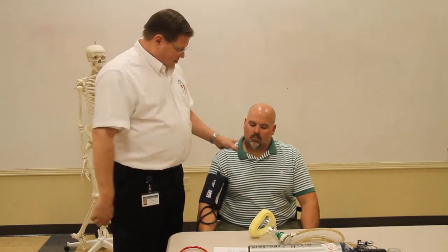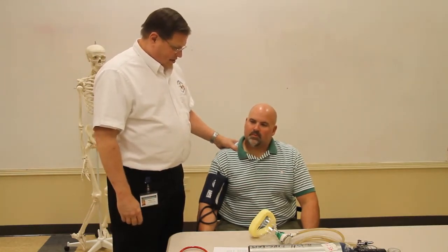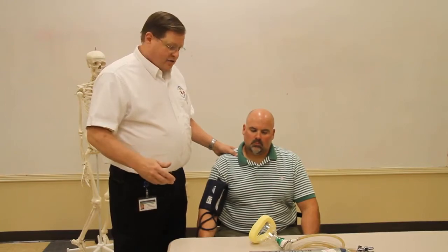So Lee, is that the case? No, no problems. Okay. So I'm going to call for physician's orders, and I'll tell him his age, and I'll tell them that he has no contraindications for nitrous oxide, that he has perhaps a long bone fracture, or what the case may be, and why I need the pain medication.